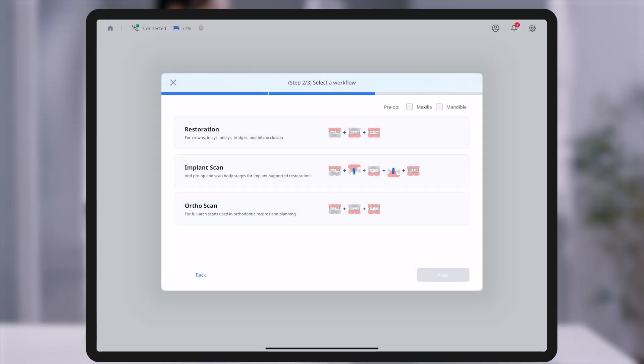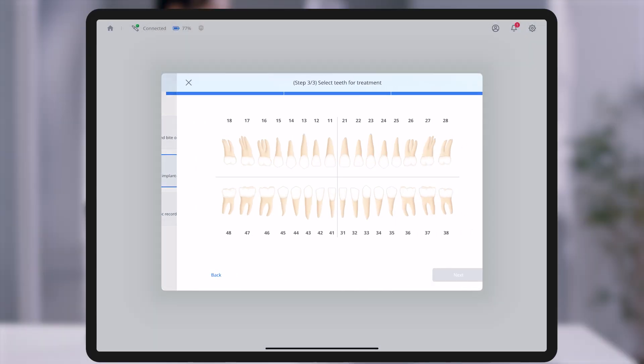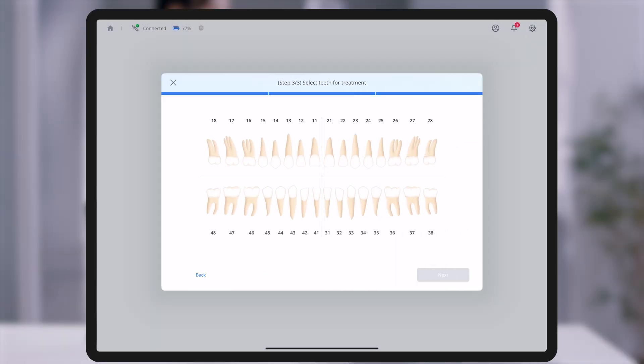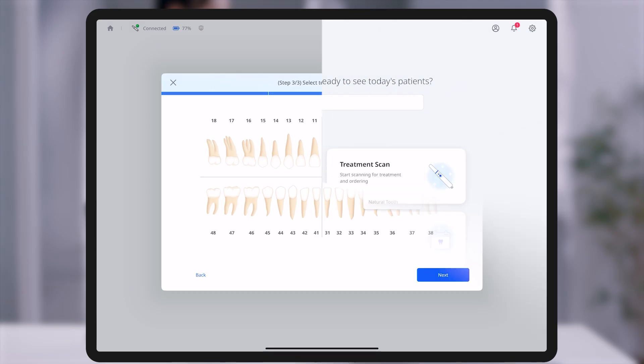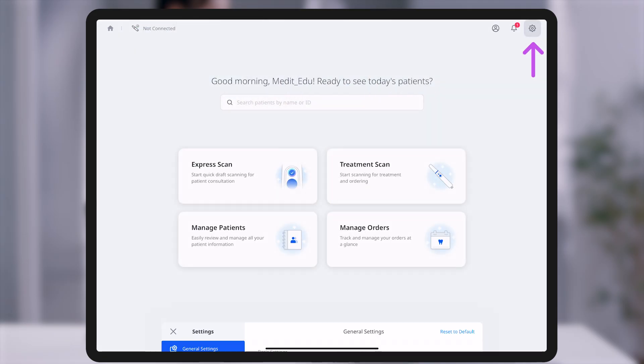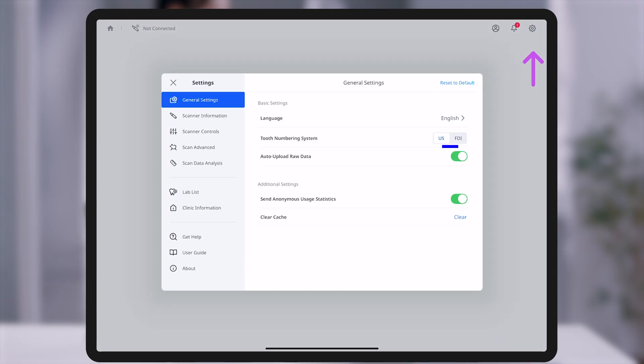After selecting the workflow, choose the teeth requiring treatment. You can switch between the US and FDI tooth numbering systems in general settings under settings.